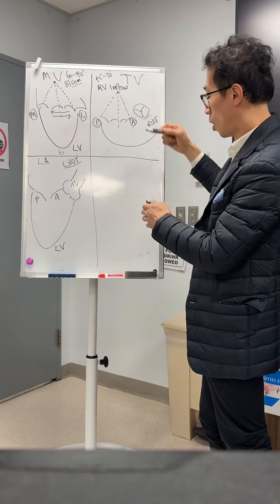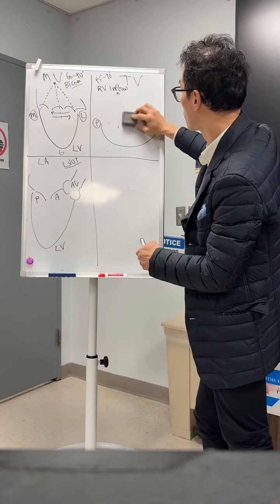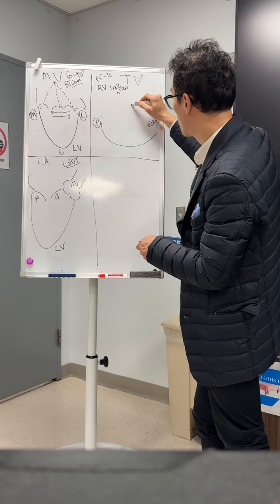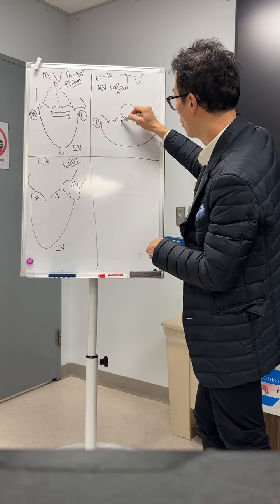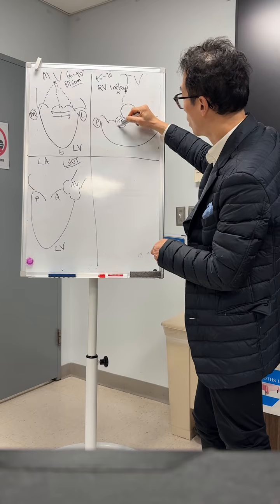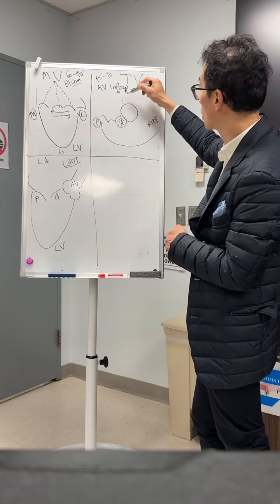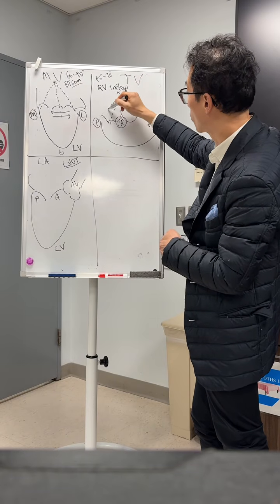Let me give you an example. I'm going to erase this for a moment. If your aortic valve sits more in the center, and you do the same kind of inflow view, your beam is here. If you're going commissural, you're going to beam through the aortic valve.